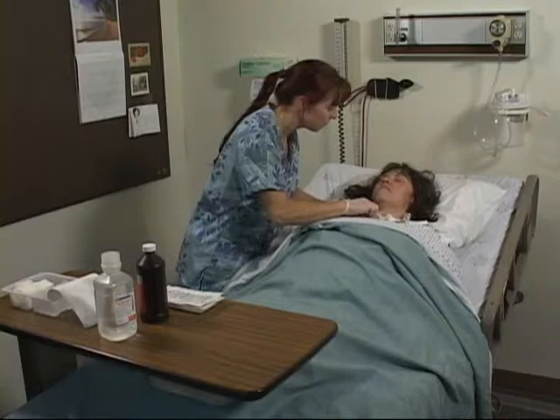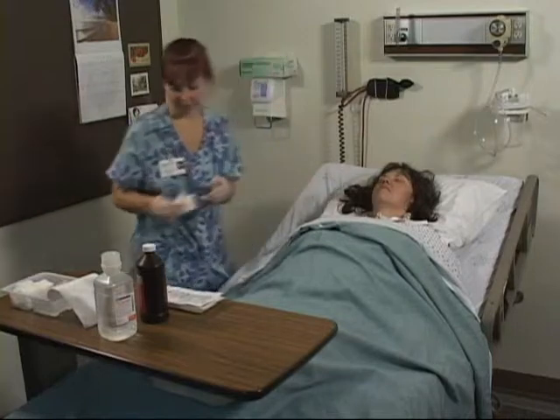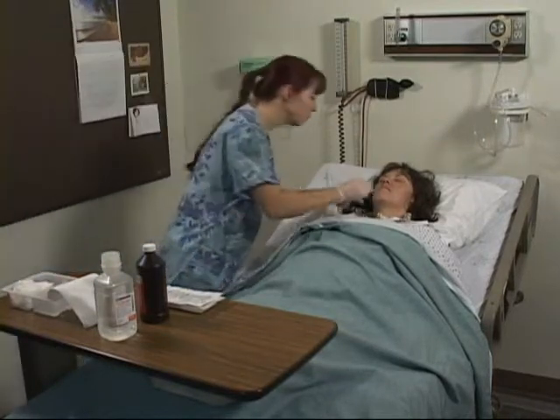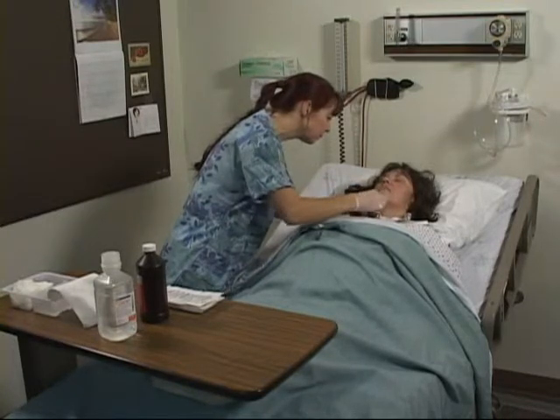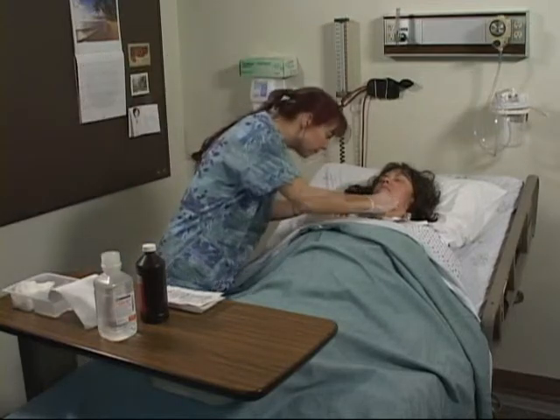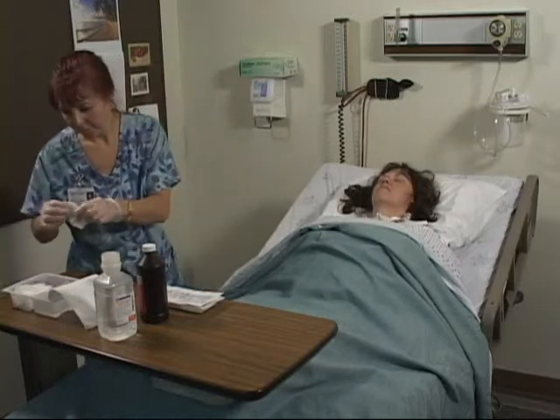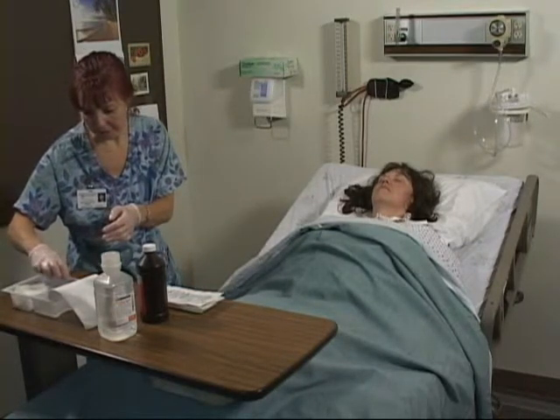The soiled dressing is removed by gently loosening it from around the neck plate. Inspect it for color and odor of drainage. Cleanse around the neck plate with cotton applicators that have been moistened with sterile saline, hydrogen peroxide, or other approved antiseptic solution. Repeat this procedure by rinsing the skin around the neck plate. Avoid dripping liquids into the tracheostomy opening to prevent aspiration, while providing a thorough cleansing of the neck plate.